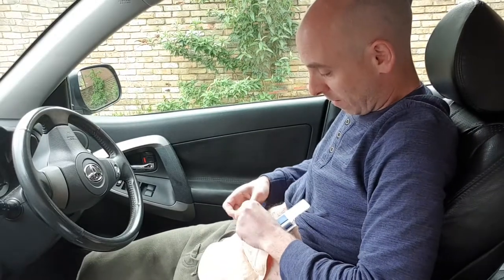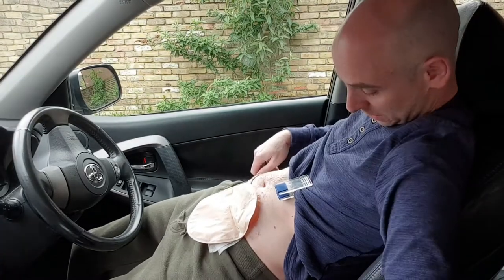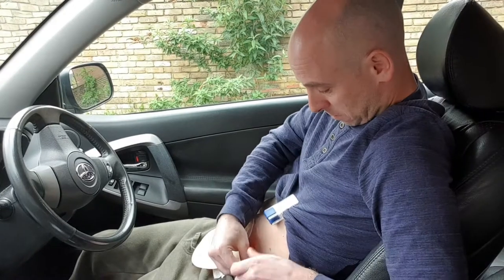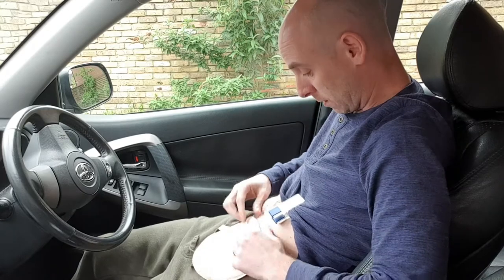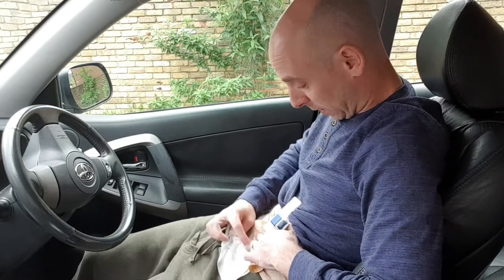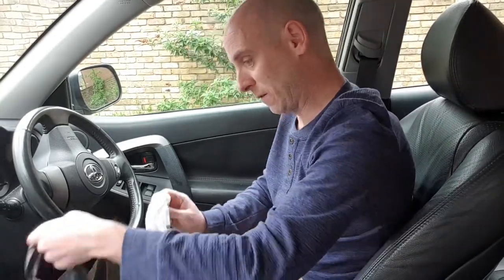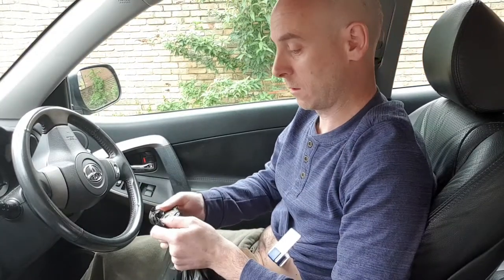Now I'm going to attach the stoma belt back on — stoma belts are great for convex bags. I've done a video on convex bags and explained why the belts are required. Clip that back on — that's pulling nice and tight, holding all flat. Just checking the rest of the base plate — that's all stuck nicely. Let's take that dry wipe off and into the bag that was hanging over the gear stick. Let's do that up. Job done.